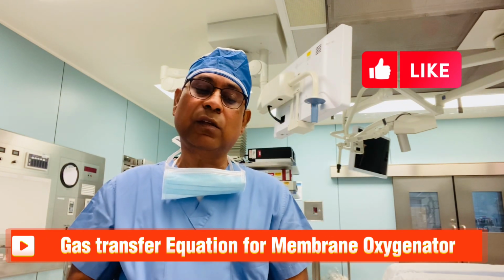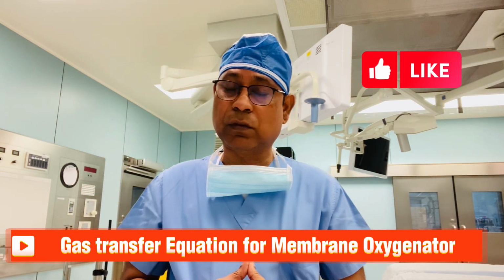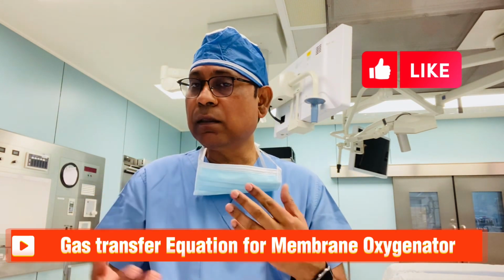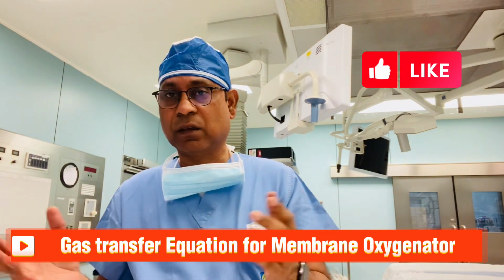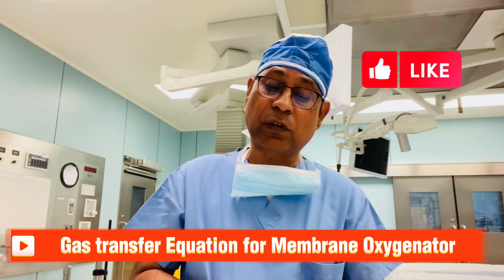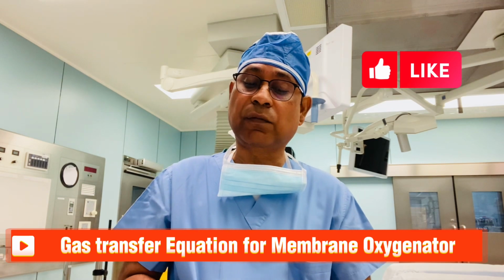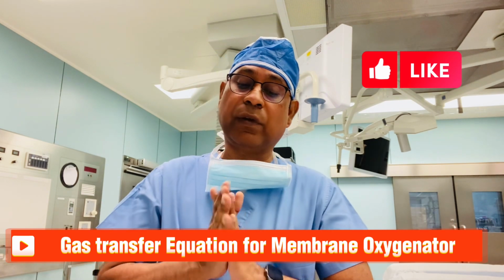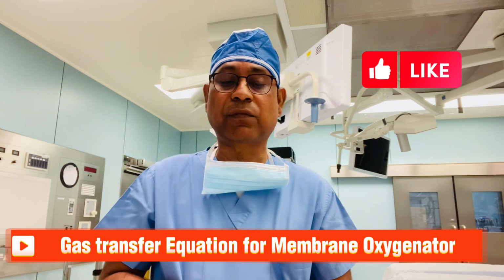So we need to understand the efficiency of the membrane oxygenator so that we can change the circuit prior to any disaster and prior to any failure of the membrane. We supply 100% oxygen to the oxygenator. To check the oxygenator function, we need to check the oxygen transfer factors. How are we going to check them?